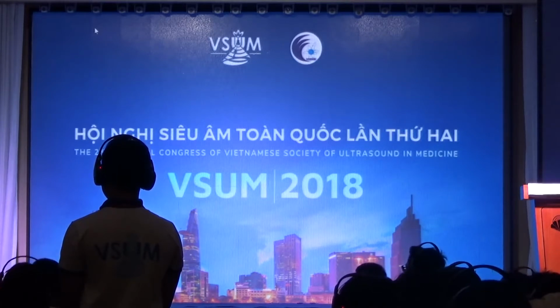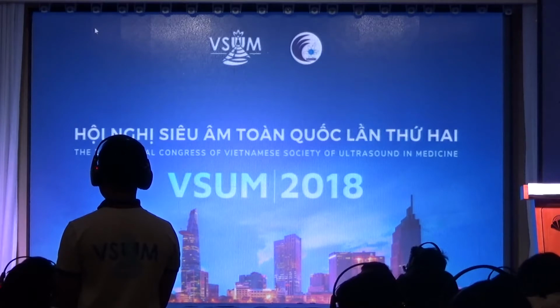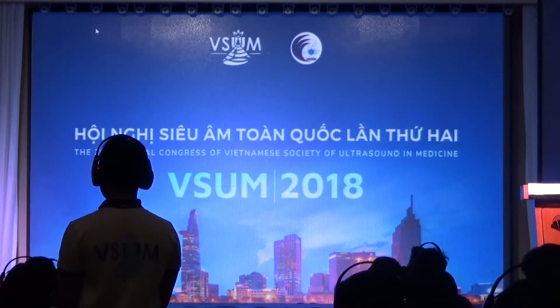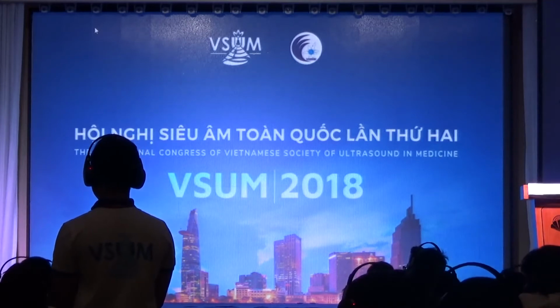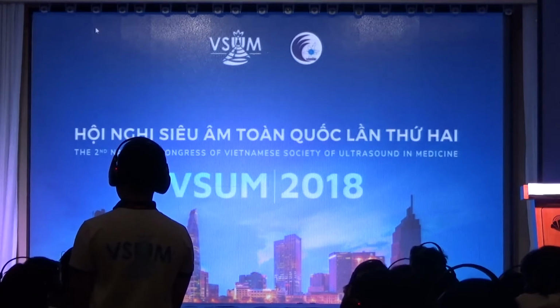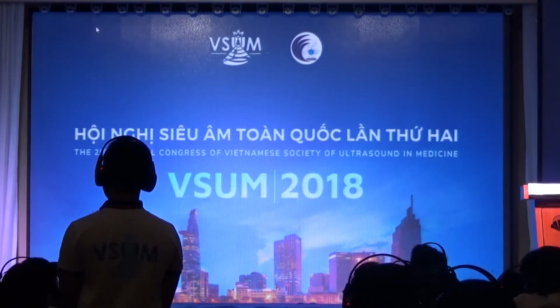One value, the low value. If it's below that, they have no or mild fibrosis. One value, that is the higher value, that we say they either have severe fibrosis or cirrhosis. And if it's in between, we say they have moderate to severe fibrosis. And I think that's all we can do because there's so much overlap and variability between patients. It's very hard for you to say, oh, this is F2. So we don't think we can do that.